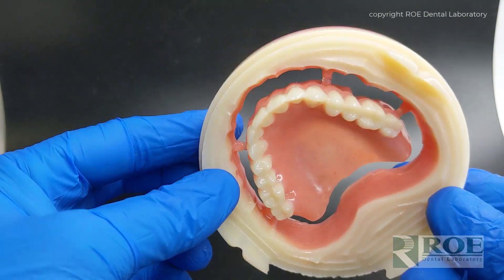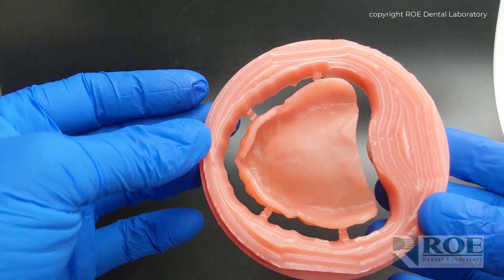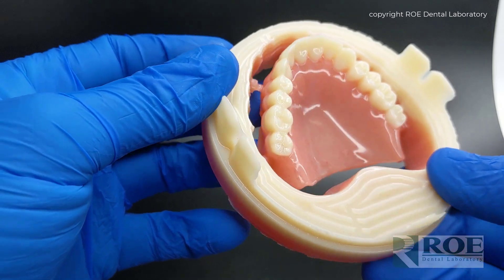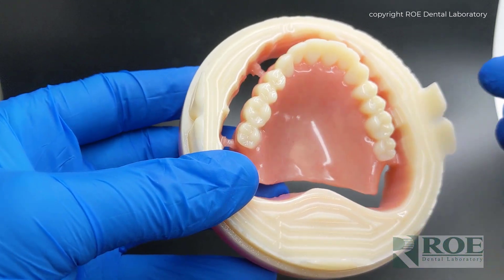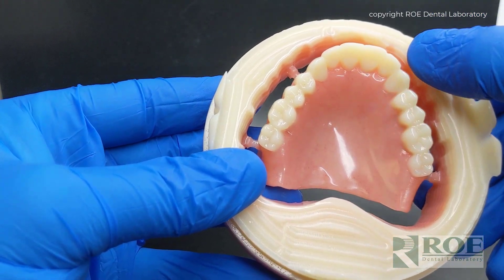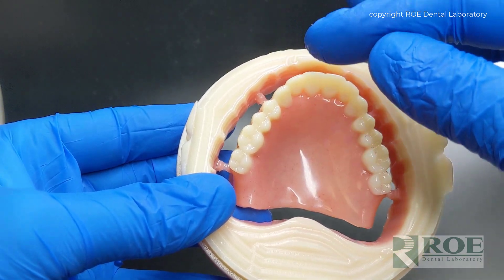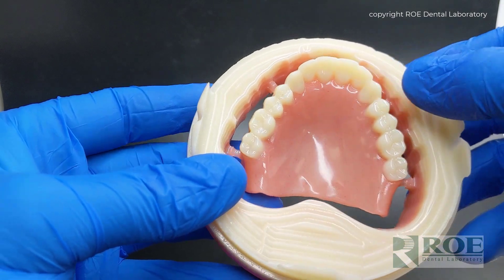Ivotion's Ivoclar Denture. This is a milled denture from a puck of pink for the base that is combined with tooth color for the teeth in one solid puck. This is a fascinating development. You can see up inside of the puck that there is scalloping that is built into the puck, which means the denture is designed and then manipulated and nested so that the gingival of the teeth match the scalloping inside the puck.